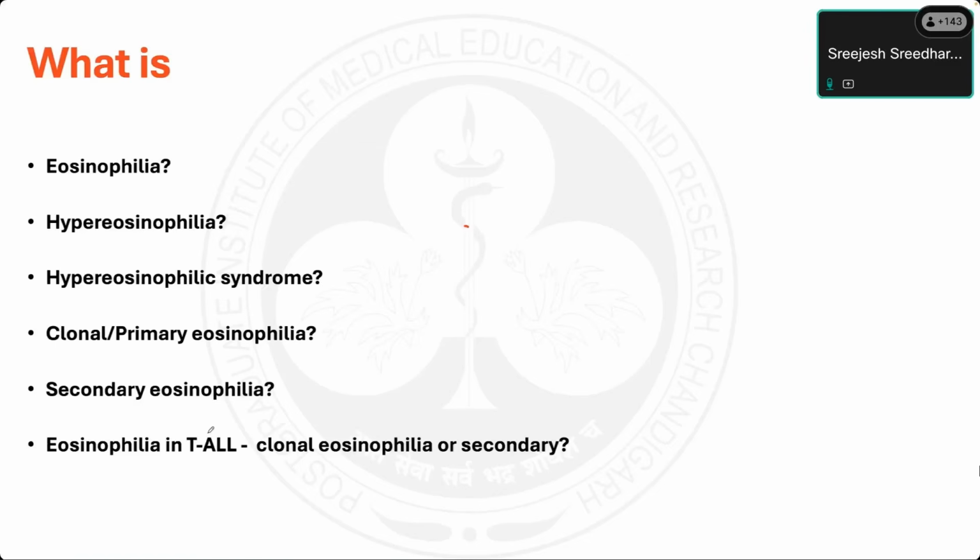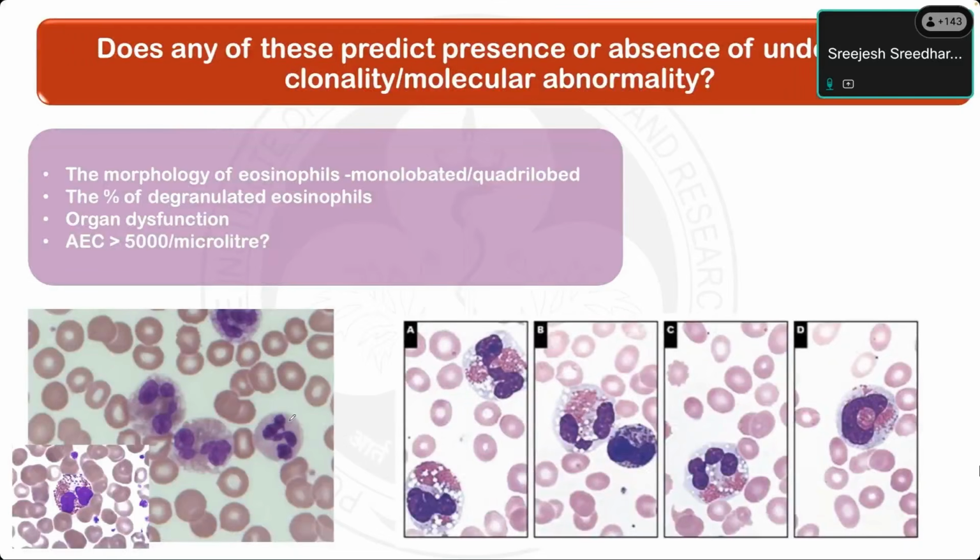Okay. So with this, one more question. Whenever we deal with eosinophils, here you can see there are eosinophils with multiple lobes. There's a neutrophil, and there are eosinophils with 4 or 5 lobes. You can see there are a lot of vacuoles here. There are eosinophils with one side completely agranular. Somebody has commented that the volume is very low. Is it the same for everyone or can you hear properly?